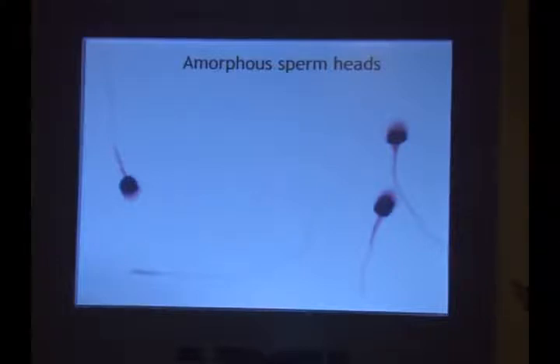But if you are not careful, you are going to call everything okay in this patient, because they are not grossly abnormal. Again an abnormal sperm. This is just to show you more and more abnormal forms, since we don't have enough time to show you individually. So I thought I will project different types of sperm and clarify the doubts here.